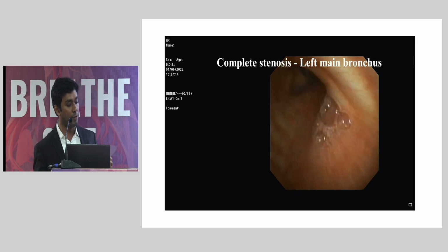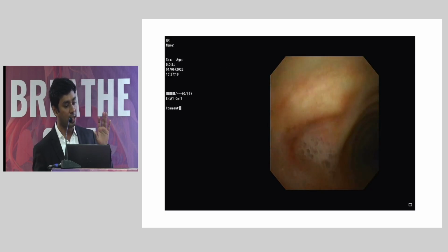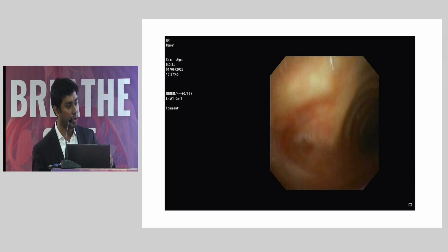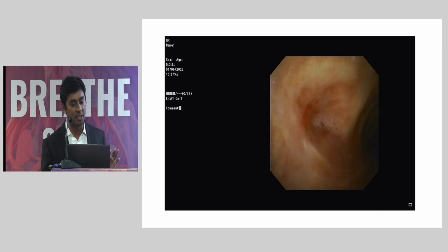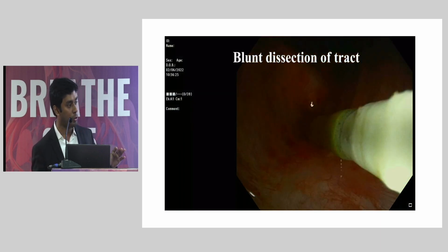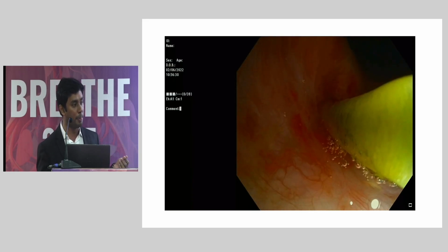We took up this patient, we did a bronchoscopy, and in the bronchoscopy you can see there is no left main bronchus. You are only able to see a remnant of a carina, and the bronchus is directly leading into the right main bronchus. Recanalizing these airways is quite difficult because while giving electrosurgical incisions, if you are wrong, you may inadvertently enter into the mediastinum and you really don't know whether the distal lung is going to be patent or not.